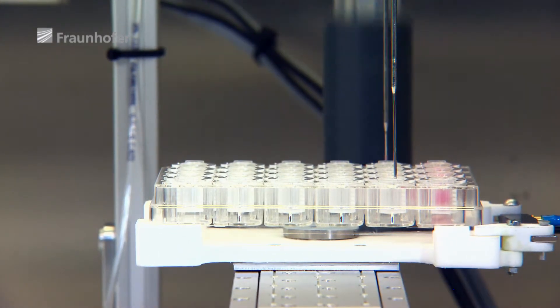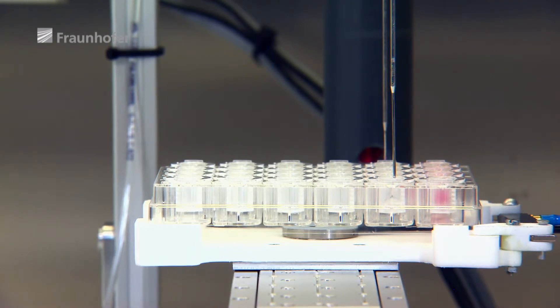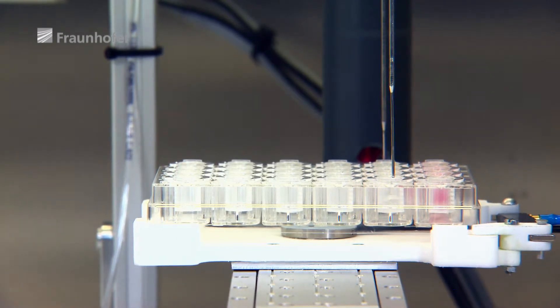In Module 3, the cultured skin cells are placed on a gel matrix. The skin tissue is able to grow here.